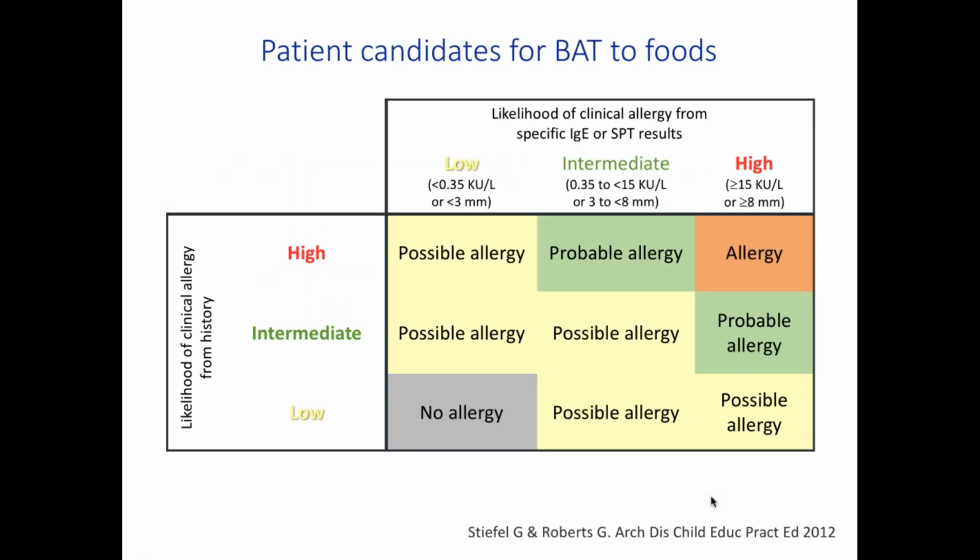But the basophil activation test has quite a few practicalities involved in its performance. For example, it needs to be done quite soon after blood collection because the blood needs to be fresh, and it requires expertise in performing flow cytometry. So, realistically, it's not a test suitable for first-line testing to screen patients coming into an allergy clinic.